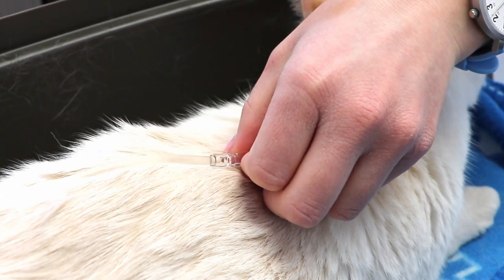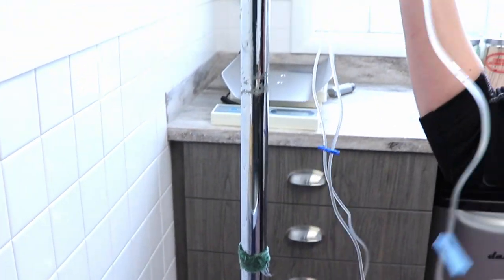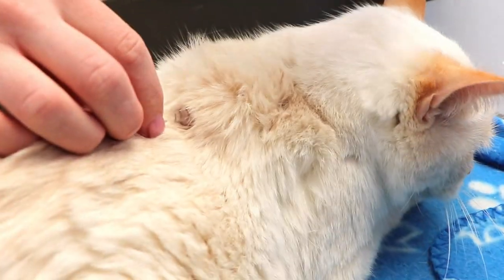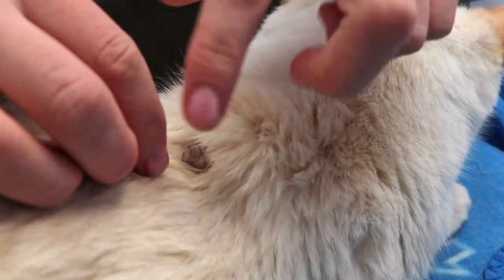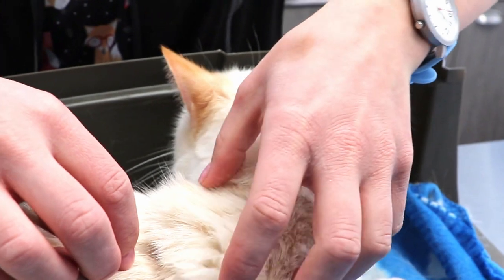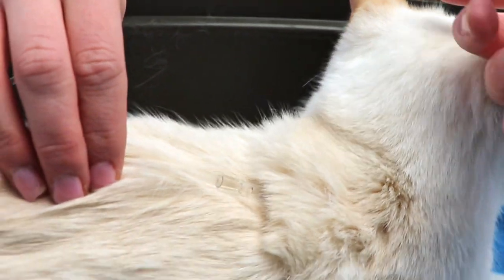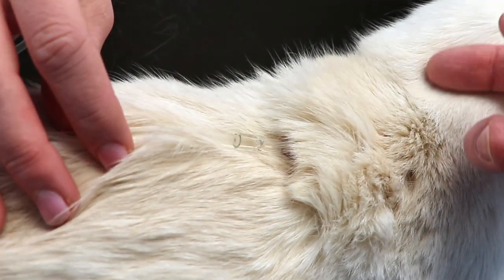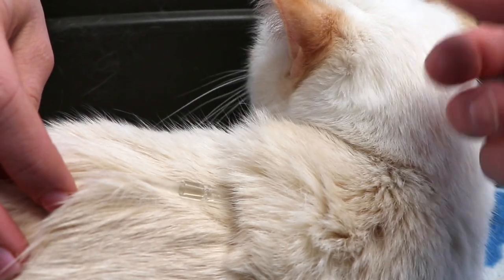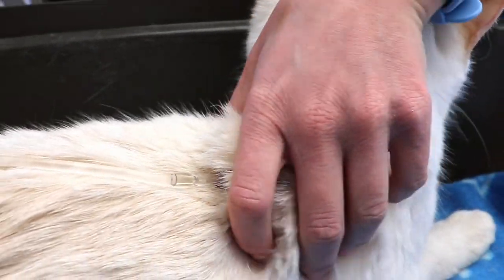Okay, and then this is the roller clamp, so you just roll it up and then it should start flowing. You'll want to make sure that — because sometimes you can poke the needle out of the skin — so just make sure there's no liquid falling out, and you can feel around to make sure the fluids are going in there. It's okay buddy, it's alright Steve. And then you'll just kind of feel a lump forming there too.